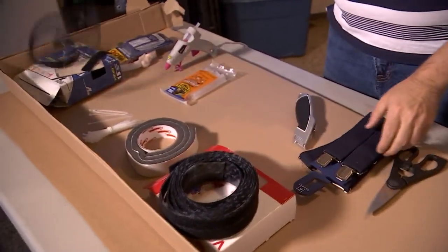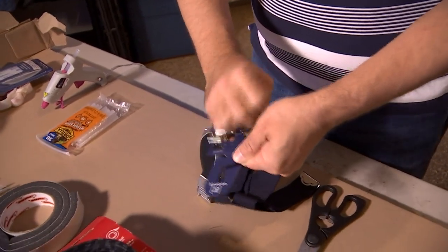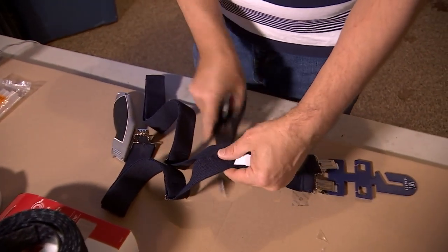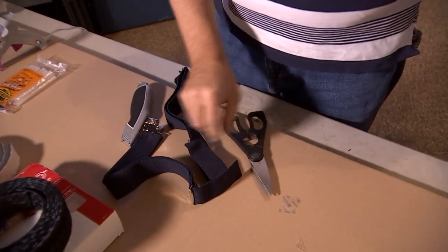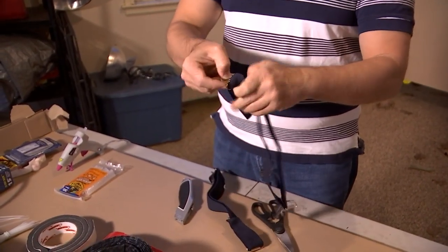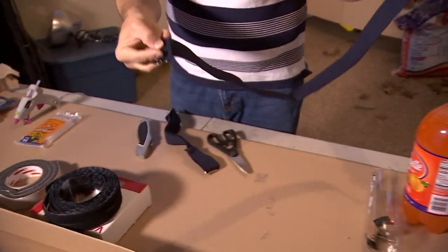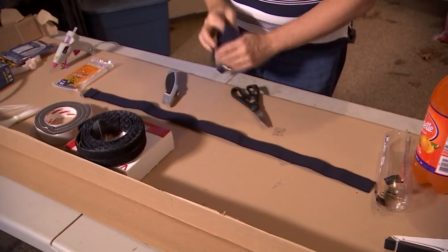For the headband, take a pair of suspenders and remove them from the wrap. Cut the back half of the suspenders clean off — you only need the two front portions, and one pair of suspenders makes two head straps. Unlock the clasp and slide it right off. Take the stitched side with the exposed stitch and leave that facing up, because this is going to be the front of the headband.